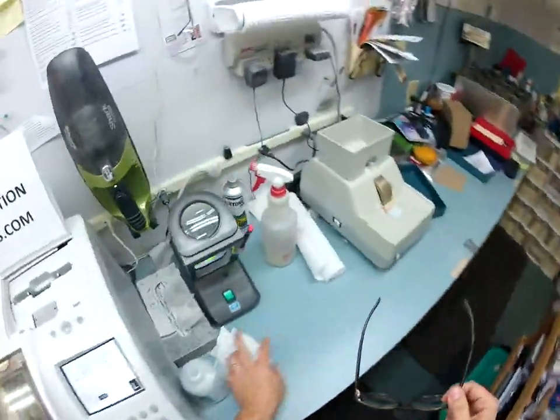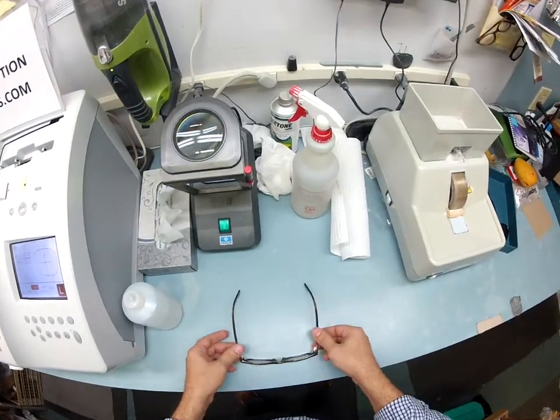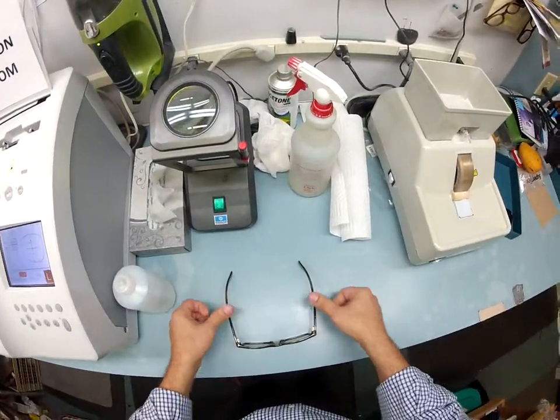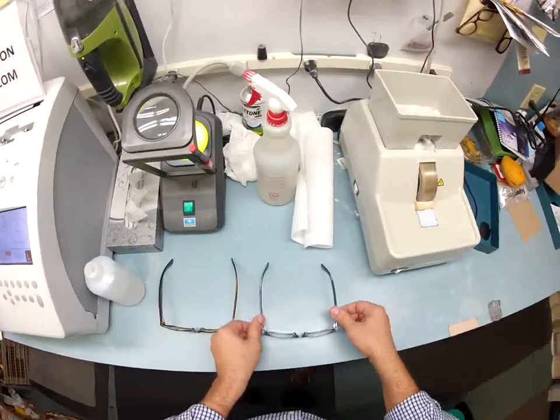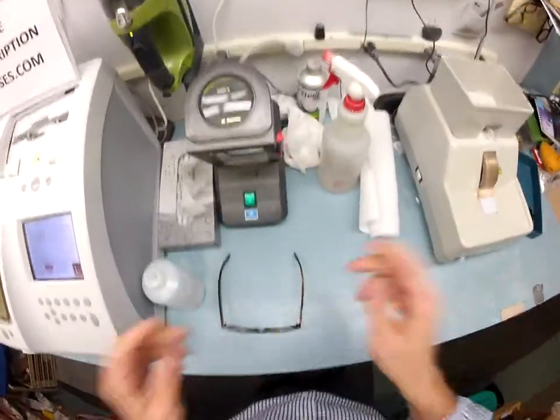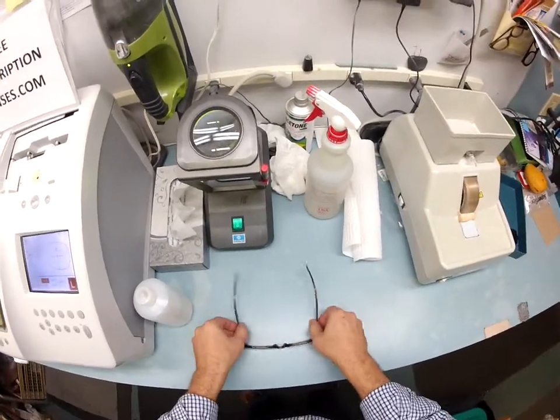So again, to put it in standard alignment, I'm going to do what's known as a 3-point stance. That 3 points is 1, 2, and the bottom of the frame being 3. I set it on the counter, put my thumbs down to make sure there's no wobble like I did with my frames, the way they wobble when I put them down. I'm going to make sure that yours don't do that. I'm going to flip it over. Same thing, I press down, there is no wobble.